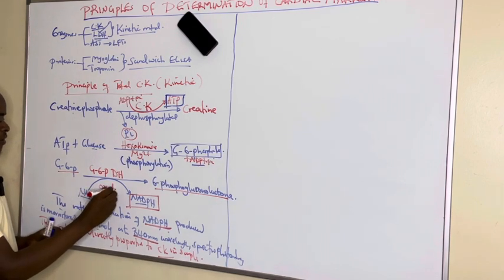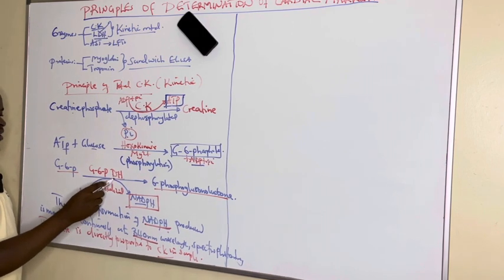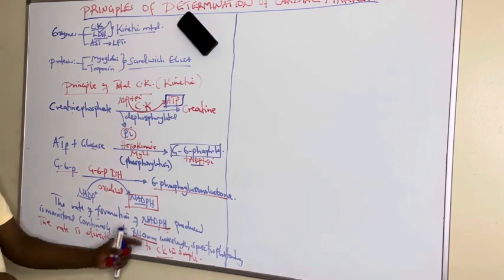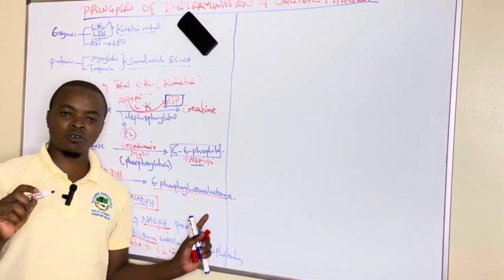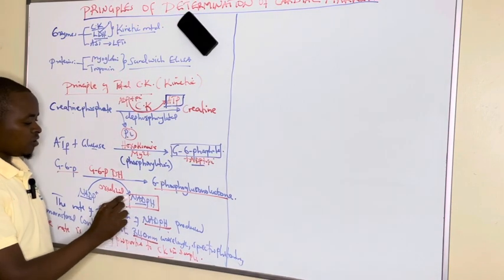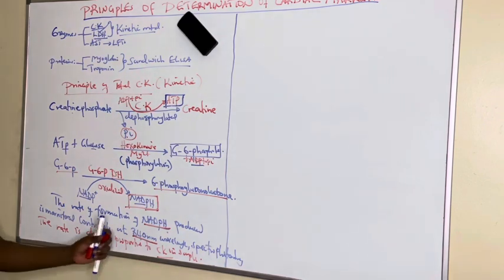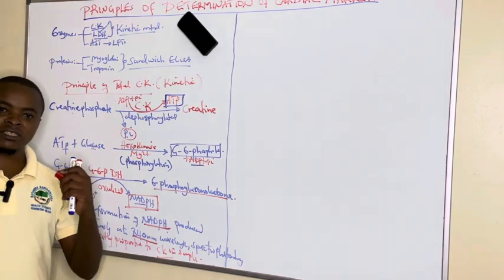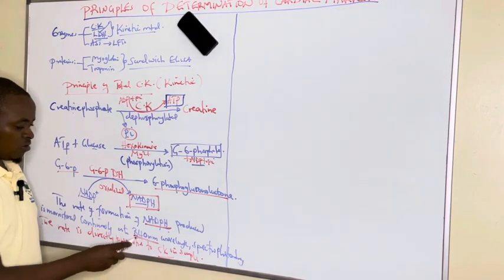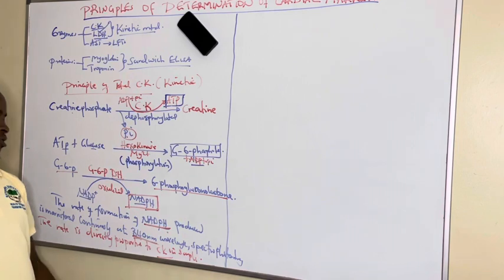Glucose 6-phosphate dehydrogenase enzyme catalyzes the oxidation of glucose 6-phosphate to form 6-phosphogluconolactone, with the production of NADPH. This NADPH produced is the one that we monitor continuously at a fixed time interval at 340 nanometers spectrophotometrically.